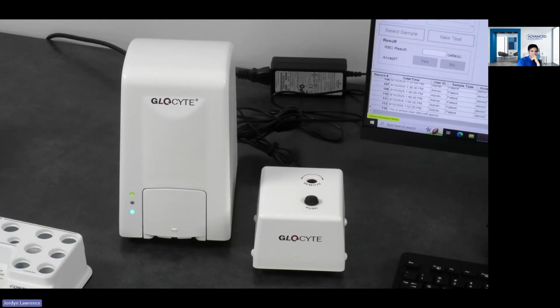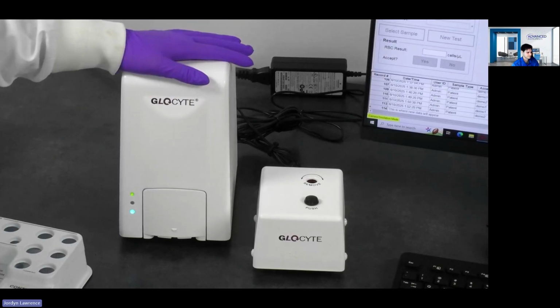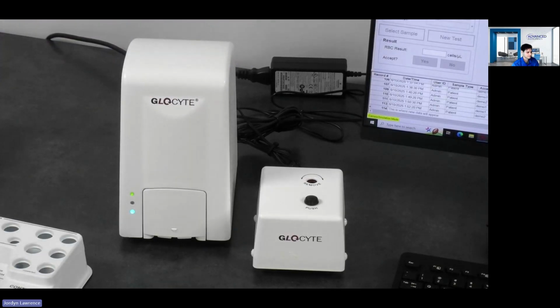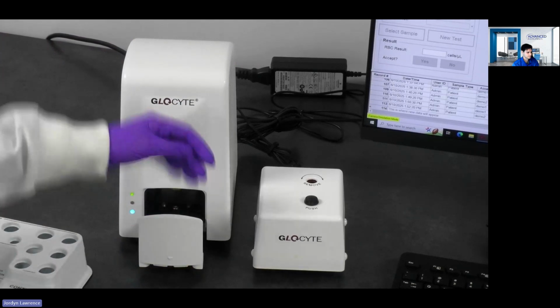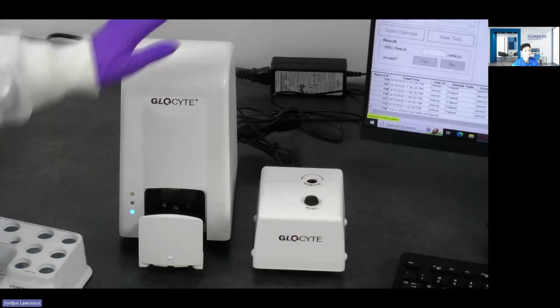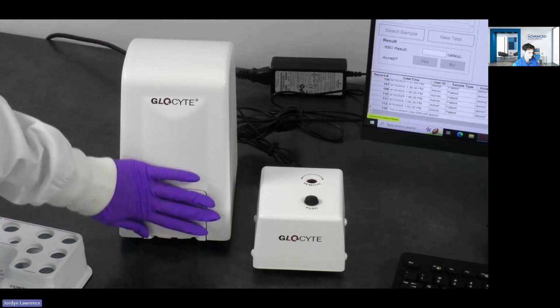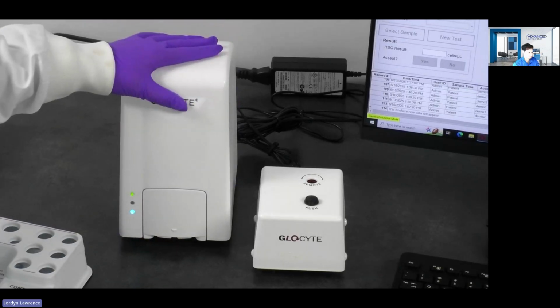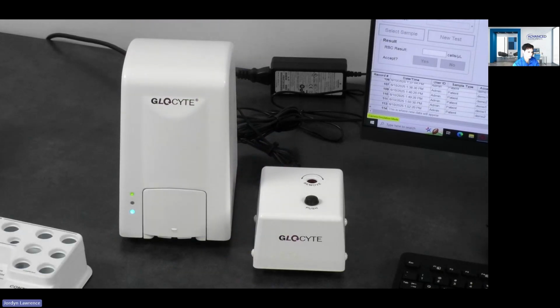So as you can see, we're jumping right into the live demo now. You can see the GloCyte is really small. This is the size of a Keurig coffee maker, basically. And it's really robust, and it's actually a simple design as well. If you open this up, which I know you're not going to be able to see, inside here is just a microscope and a light source. That is all that is there with the GloCyte. It was designed to be really robust and simple. And right here next to it is the vacuum station. I'll go over that in a second.